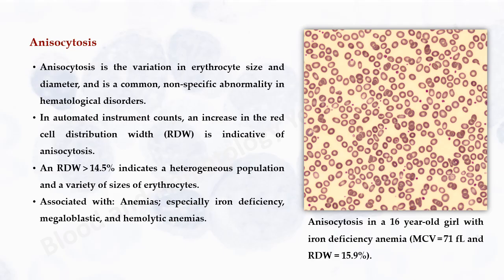Anisocytosis is associated with anemias, especially iron deficiency, megaloblastic, and hemolytic anemias.